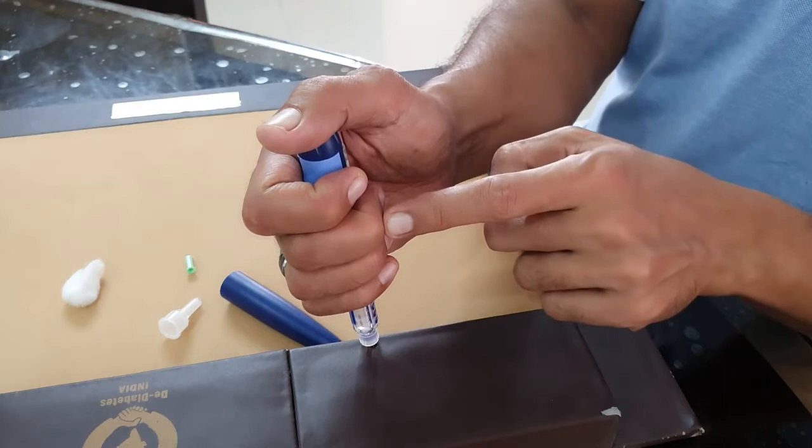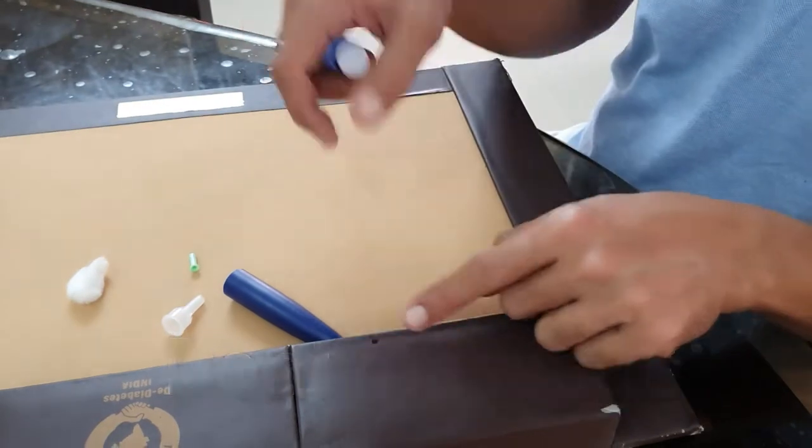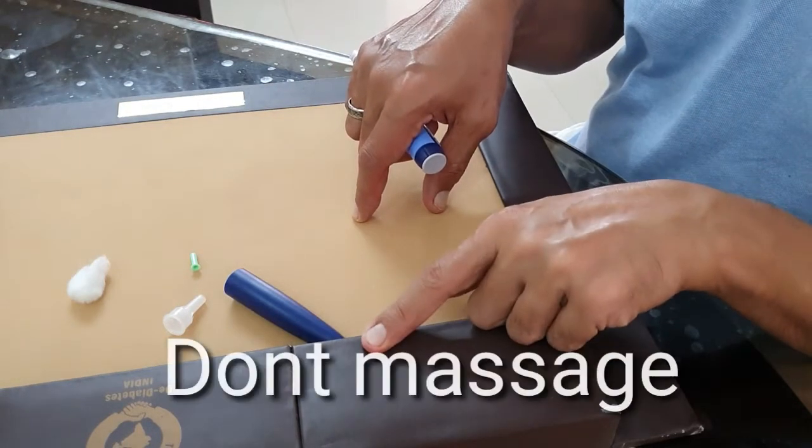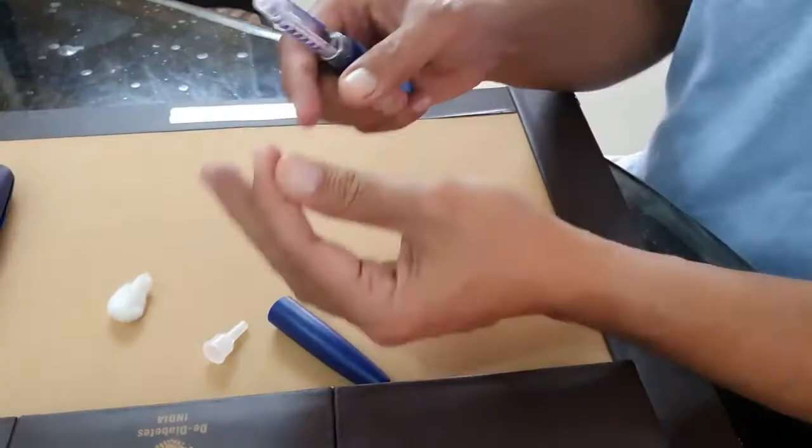Once you inject, you're going to press it and you can see the dial rotating and going back to the original position. After that you take it out. While taking out, you may see some amount of little bleeding but don't worry too much about it.